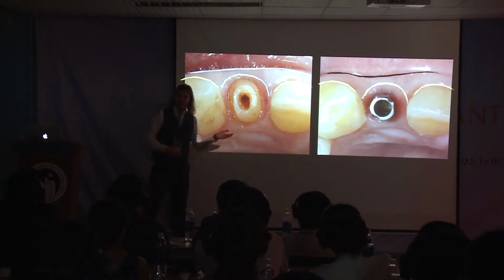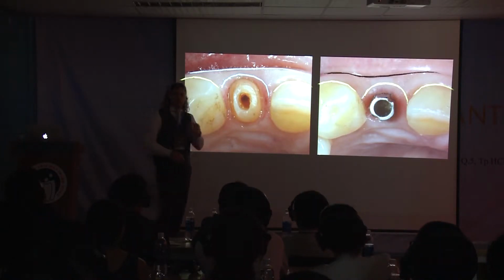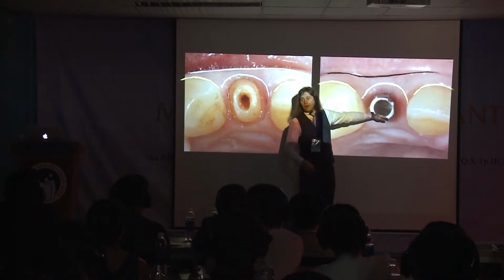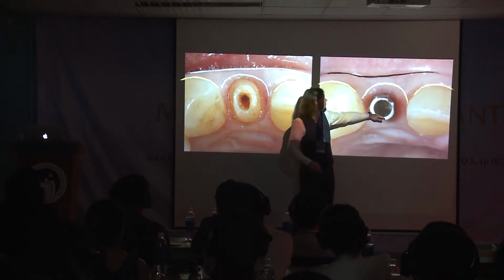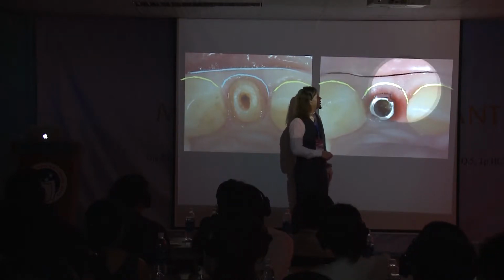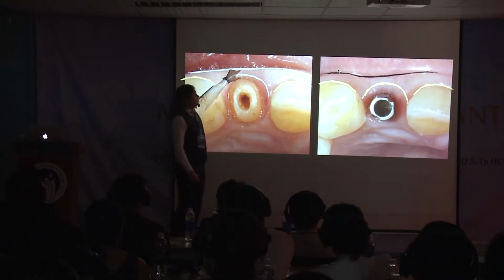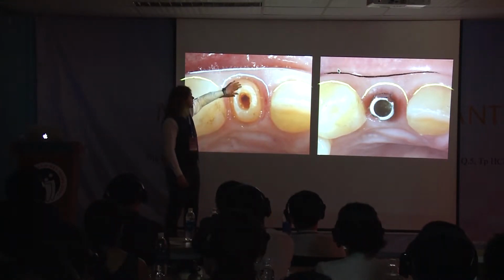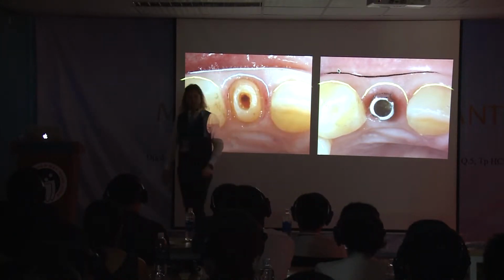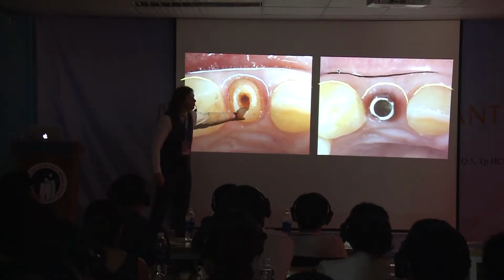Araujo says this very clearly. But now you can understand that positioning the implant more palatal, I have more thickness of tissue here compared to natural teeth. If I place the implant in the middle, now I would have a recession. So please always place the implant in this position, palatal position.